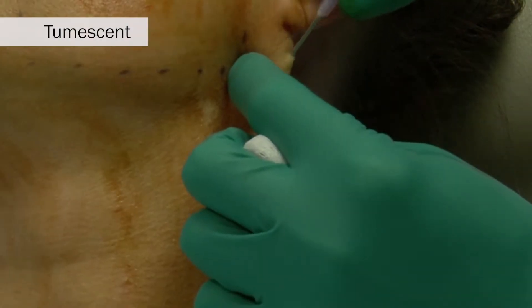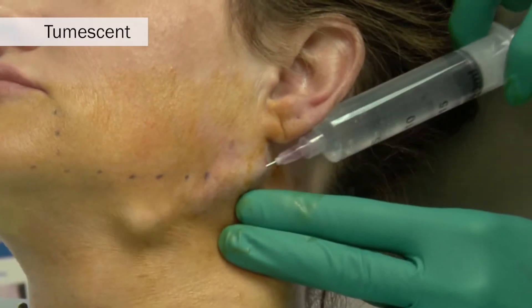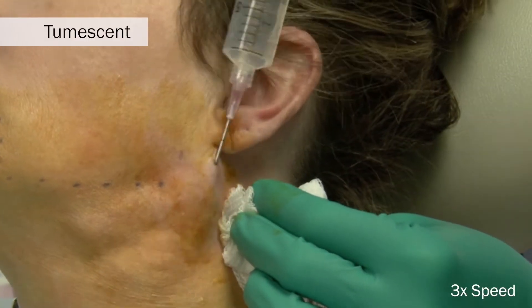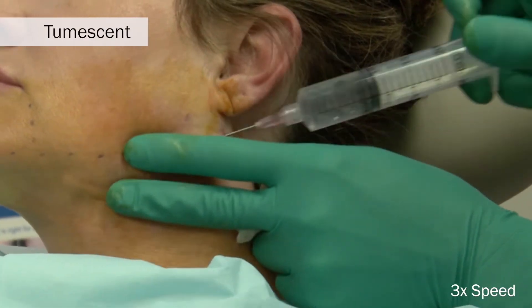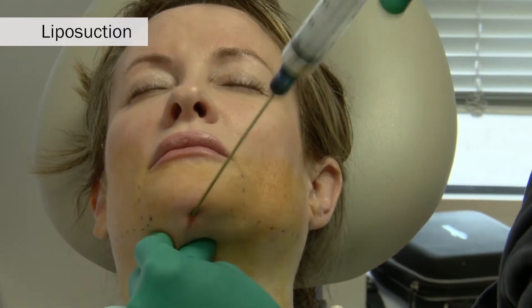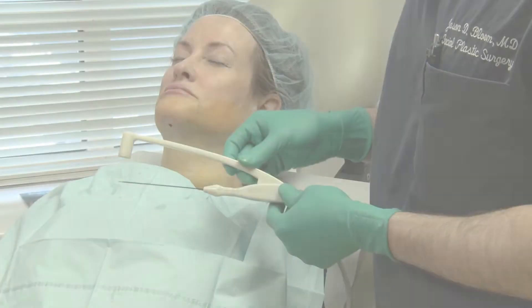A 16-gauge needle is used to create the pilot port holes for which tumescent anesthesia solution is instilled — first in the lateral neck, using an 18-gauge cannula to instill the tumescent solution, and then in the submental and central neck areas. If you choose, a small liposuction cannula can be used to reduce some of the submental and lateral neck fat.